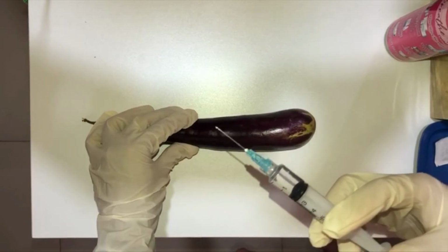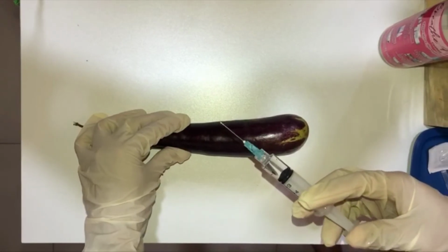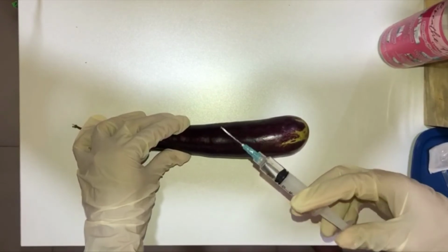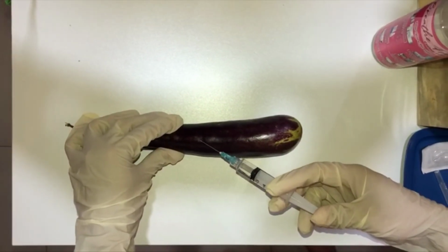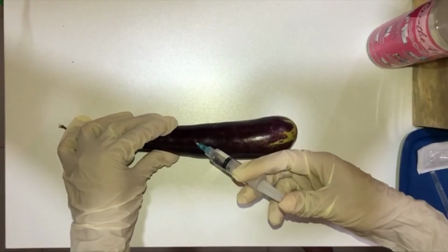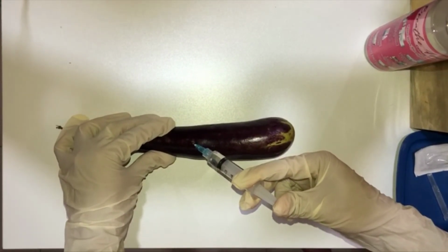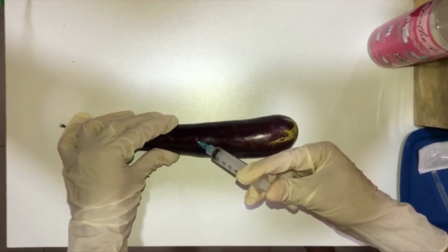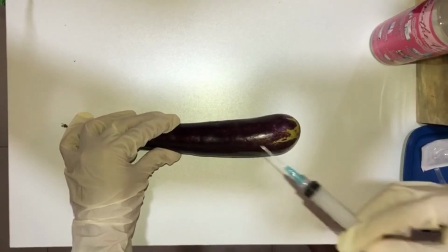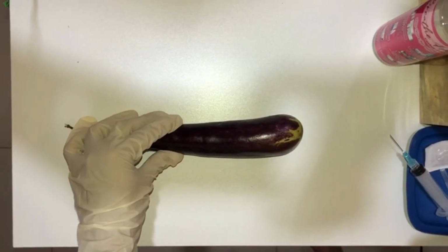Rest your non-dominant hand on the patient. Move your dominant hand to the end of the plunger and slowly inject the medication over several seconds. Retain your grasp on the syringe to keep it still. Quickly withdraw the needle, place the swab on the site and apply gentle pressure, but don't massage.